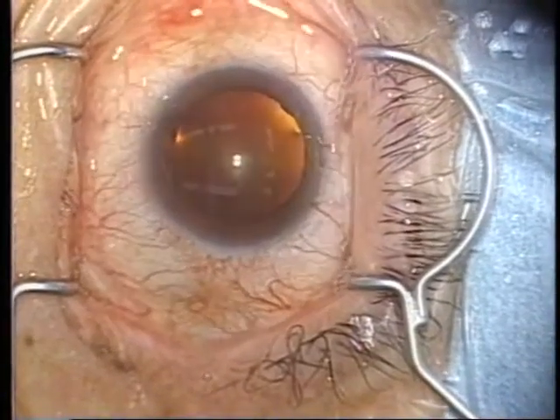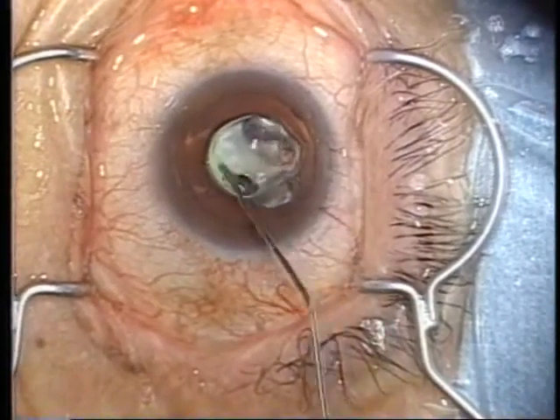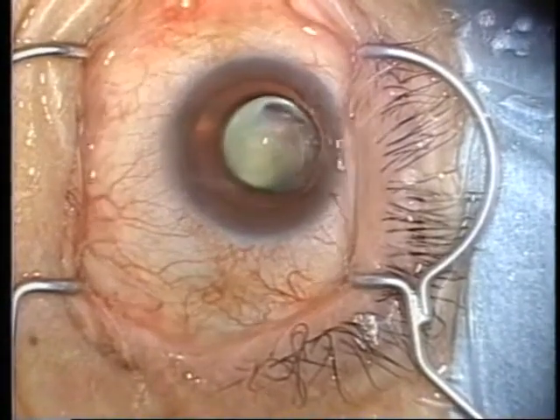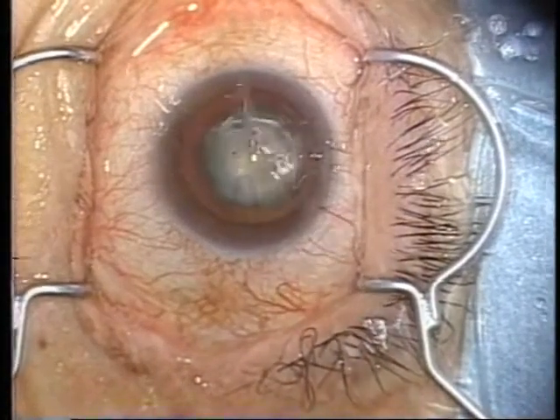Coat the cornea with viscote and drop an ophthalmic anesthetic and perfusate onto the applied viscote. Although the corneal surface is rough immediately after viscote has been applied, the perfusate will make it smooth and a uniform layer of viscote will cover the entire surface. Immediately good visibility can be obtained.